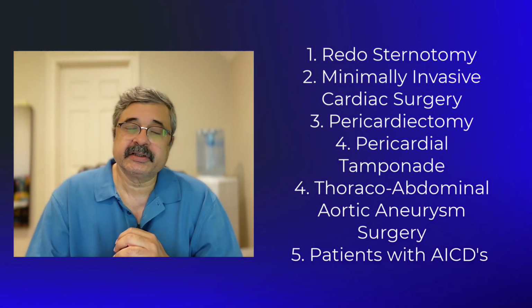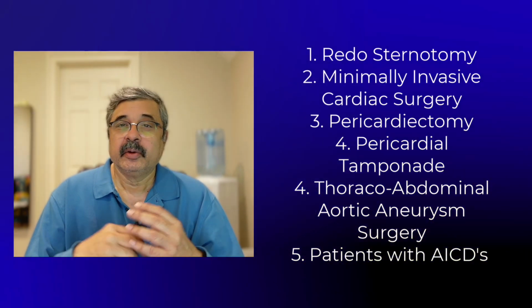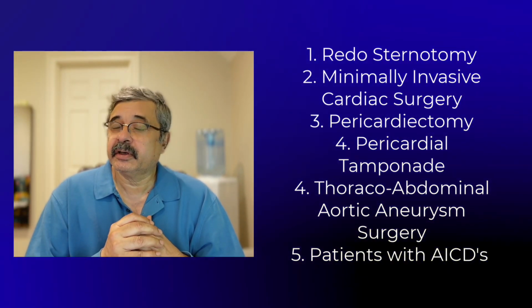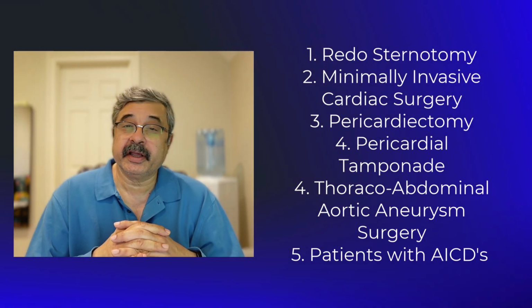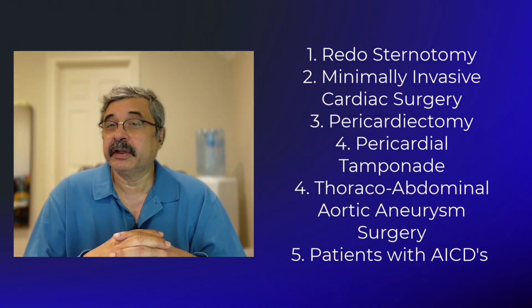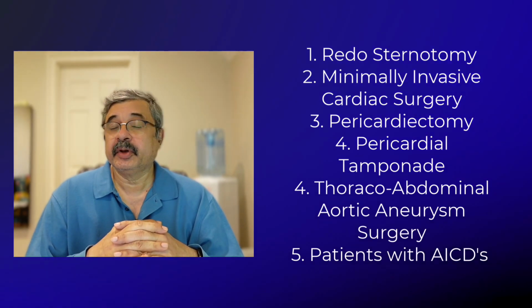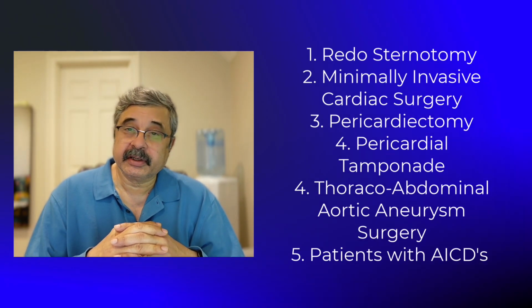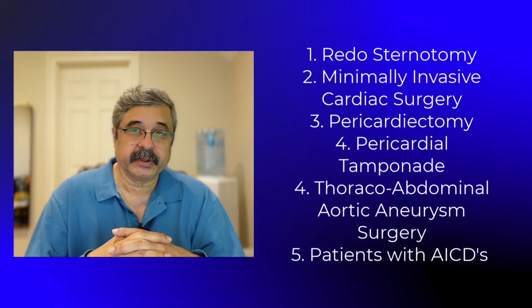So redo cardiac surgery is an absolute indication, as is minimally invasive cardiac surgery, in situations when the heart is being exposed through a left or right thoracotomy, and therefore internal cardioversion paddles cannot be applied. Another very important indication is patients undergoing pericardiectomy, when electrical bovie is being used in direct contact with the myocardium, leading to a higher risk of arrhythmias, as is pericardial effusion drainage. Drainage of chronic effusions can also be very hazardous, and patients are particularly prone to arrhythmias when the pericardium is open or electrocautery is used during that.